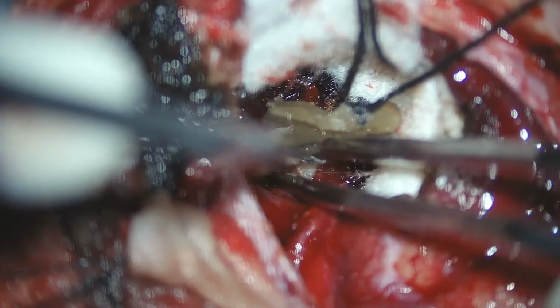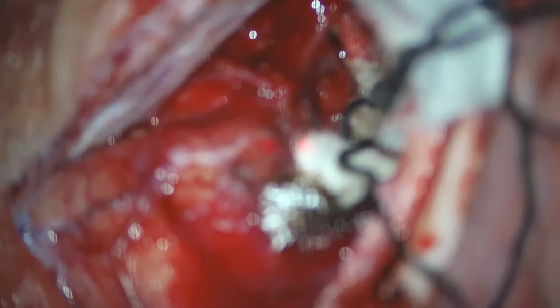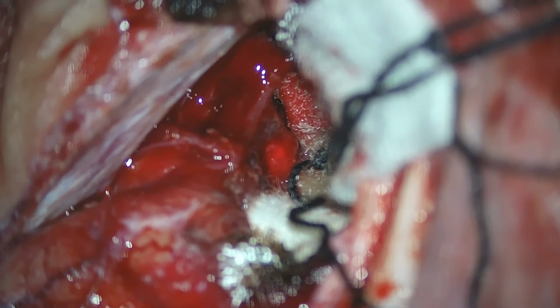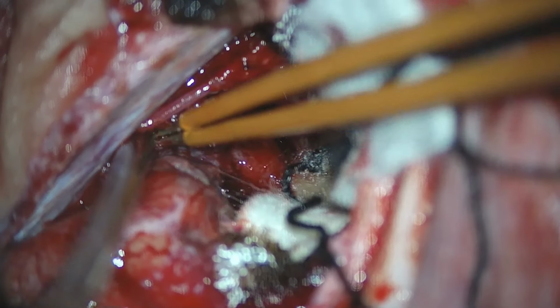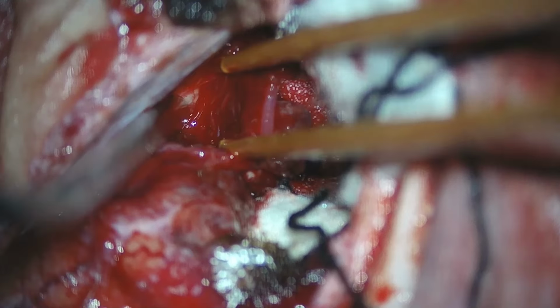Now we are moving to the medial aspect of the tumor. We adjust our microscope in a way that we are looking into the falx and the medial aspect of the tumor and the interhemispheric area. We slowly lift the cortical vein and we go under it, and we slowly debride the tumor.